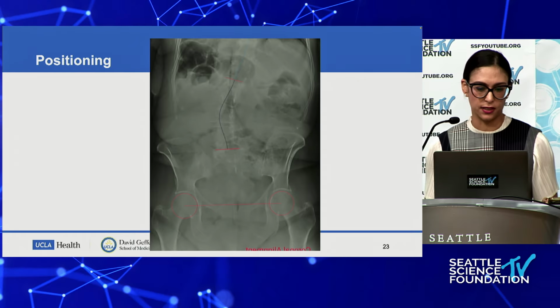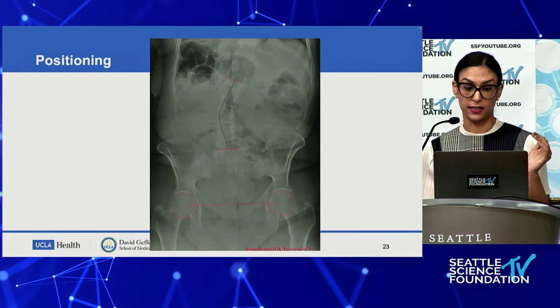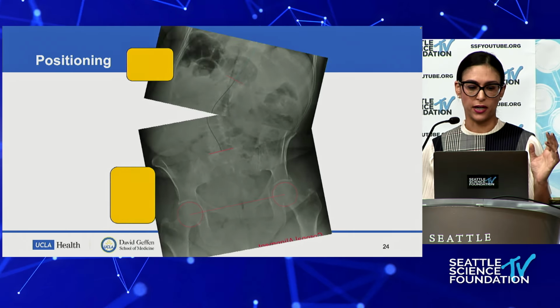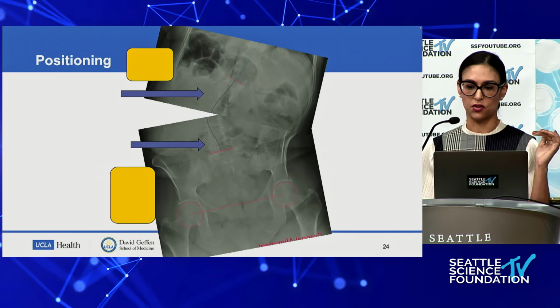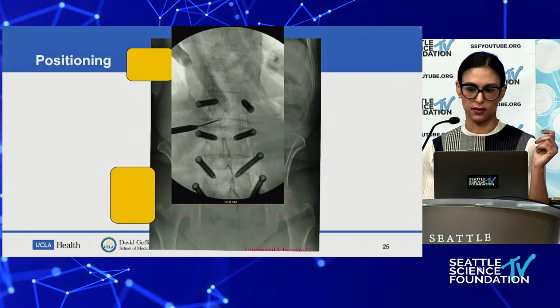For positioning, again, this is that patient where I still had to go on the convexity because of her psoas anatomy. So with these bolsters, you put them against the patient, and they do break it. It's not really like the spine. What they end up doing is actually just breaking the pelvis away and the ribs away, so it really gets you access to those two disc spaces. As you can see, it ends up not being as curved as it looks.